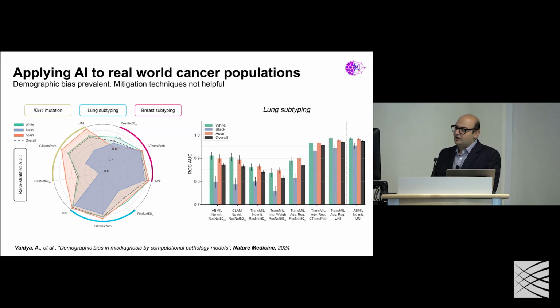And we found that there can be large disparities, but we also looked at what modeling choices could mitigate those disparities and found that feature representation is the most important component. But just improving feature representation does not eliminate all of those disparities, and we're investigating why they exist. Sometimes it could be very obvious. An example would be that patients with socioeconomic disparities might just be diagnosed late, and there might be limited advanced cases within your test set.